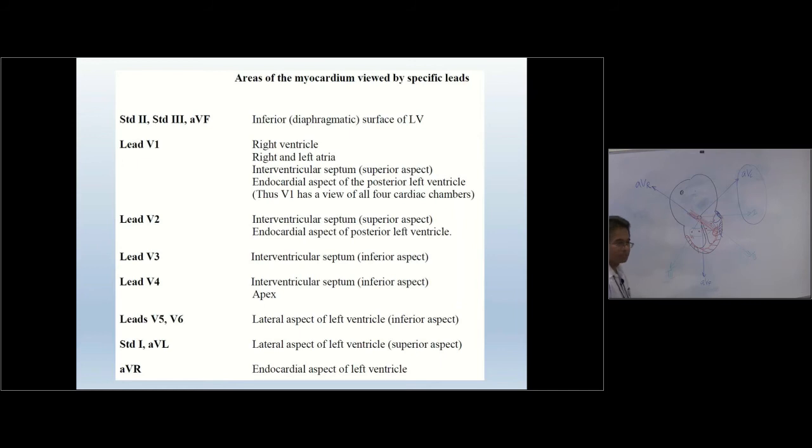Now, positioning electrodes around the heart is like positioning telecameras around a football oval. All right. A single event happens and the 12 telecameras telecast it in 12 different ways. If the player kicks to a goal, the telecamera next to the goal will see the ball coming towards it, and it will show a big ball directly towards the camera. That's the way lead 2 will show a big wave on that side.